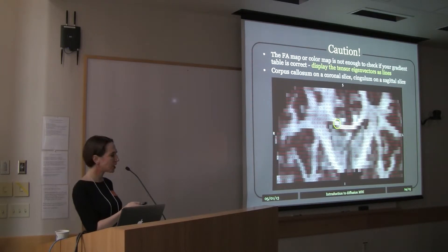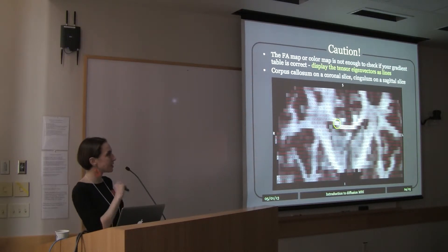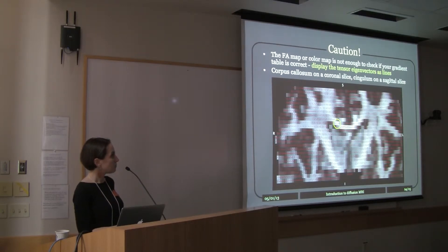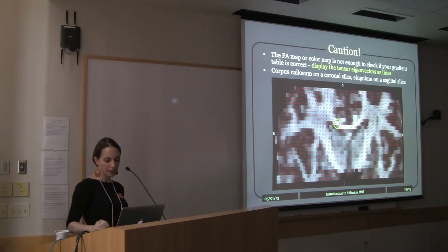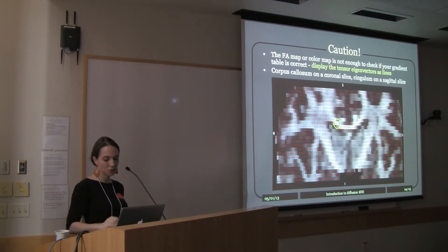You can look at a coronal slice where you can see the corpus callosum. You can look at the cingulum on a sagittal slice, make sure the directions are following it correctly, and also the corticospinal tract to check the inferior-superior direction.